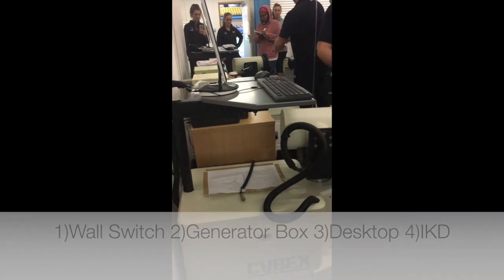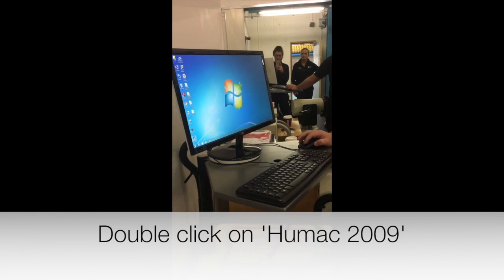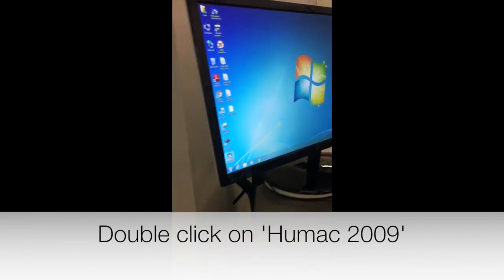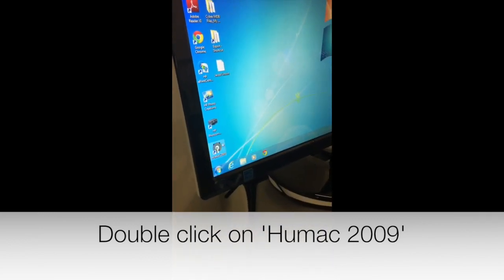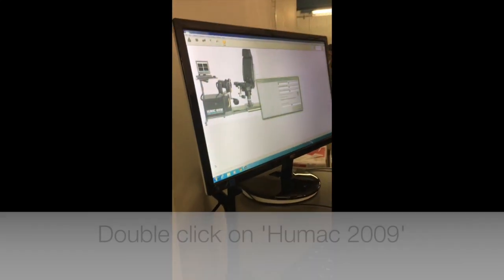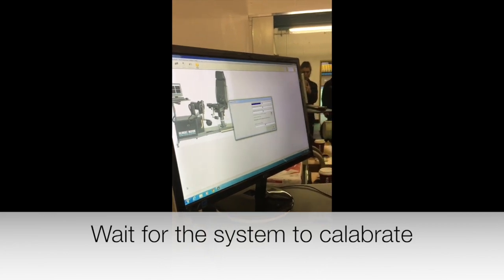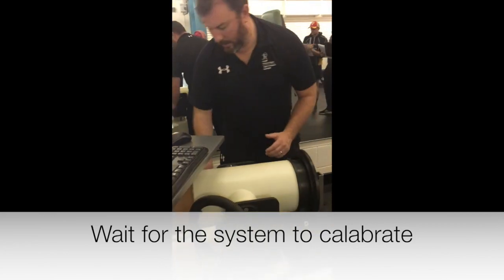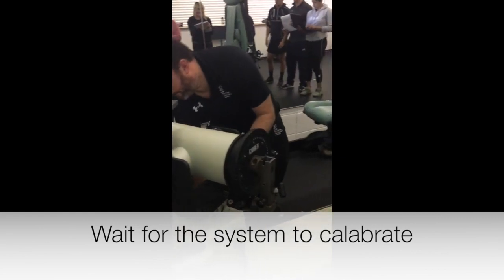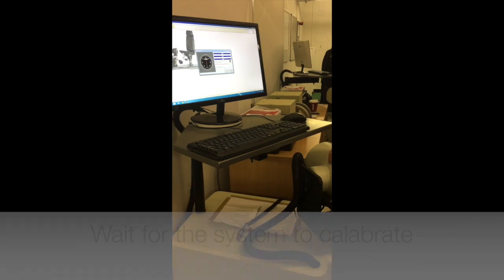Yeah? The only one you're really interested in down here is the bottom left, Humac 2009. So this one here. Obviously, double click. And now it'll do this sort of calibration. So you need to make sure, if I turn this so you can see, it takes a little while to fire up.